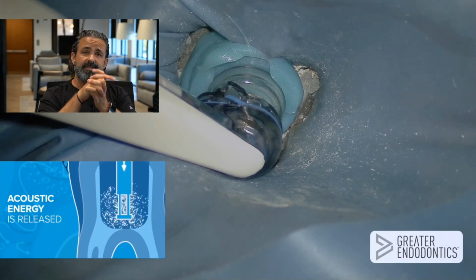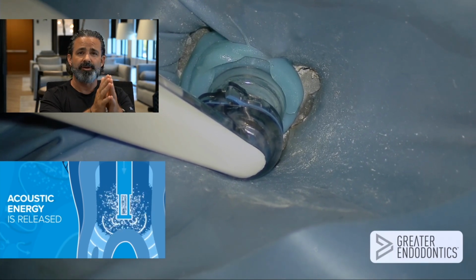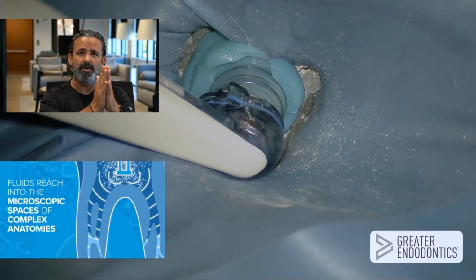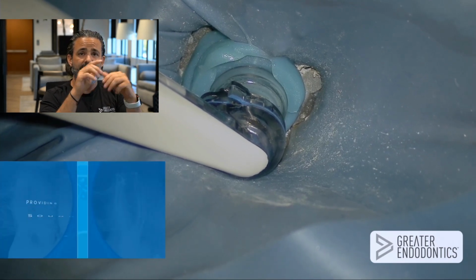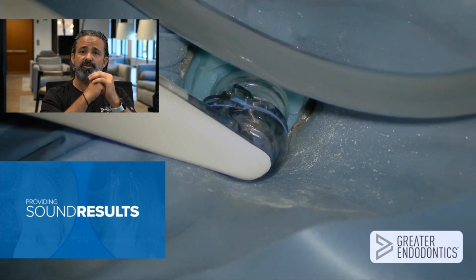Now, through the sound bar, there's always a conversation about where cavitation occurs. I get asked this all the time, and it really occurs at the window of the sound bar. So the sound plate is like a dome or a cup, and they've spent who knows how much money trying to figure out the angle of that to redirect the internal stream.